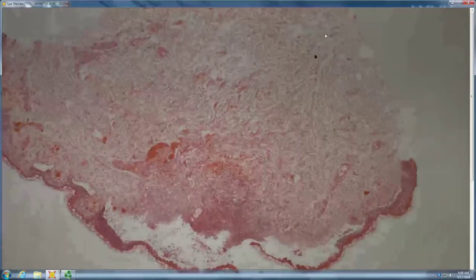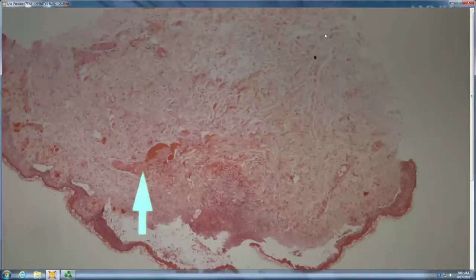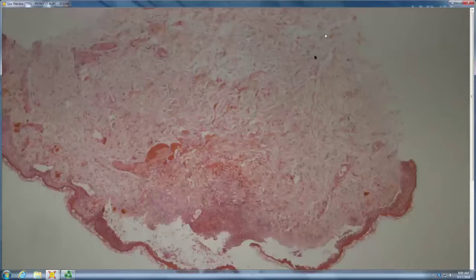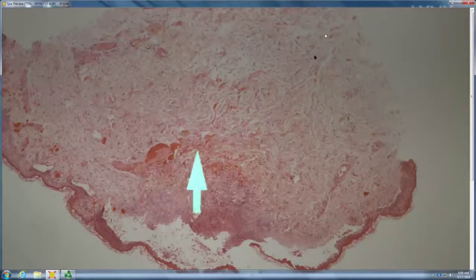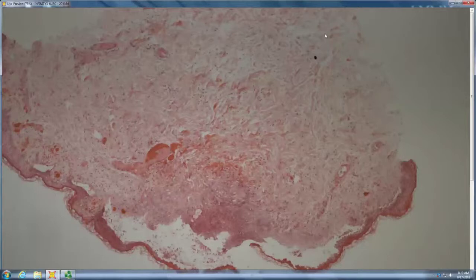Some kind of bullous eruption, EM as well. Do those usually get lots of clot? No. So thrombotic disorder with bulla is a really, really good thought. But with all the inflammatory cells there, it could just be because it's an old bulla, but the inflammatory cells go pretty deep in perivascular as well, with eosinophils. So what kind of subepidermal bulla has lots and lots of clot associated? Anyone? Tick bites. The thrombi are really characteristic of a tick bite reaction.